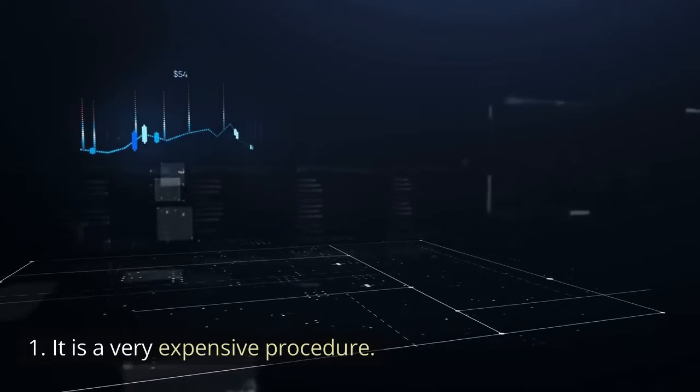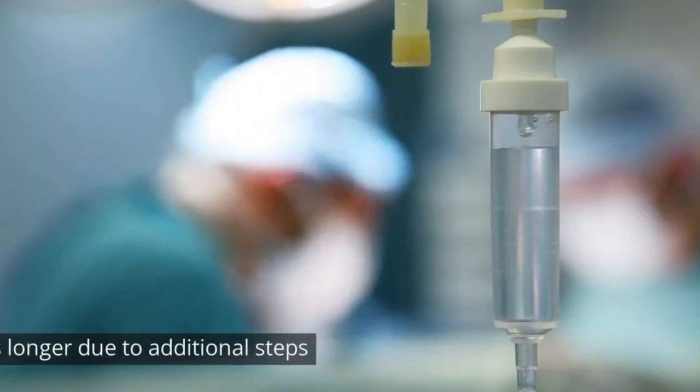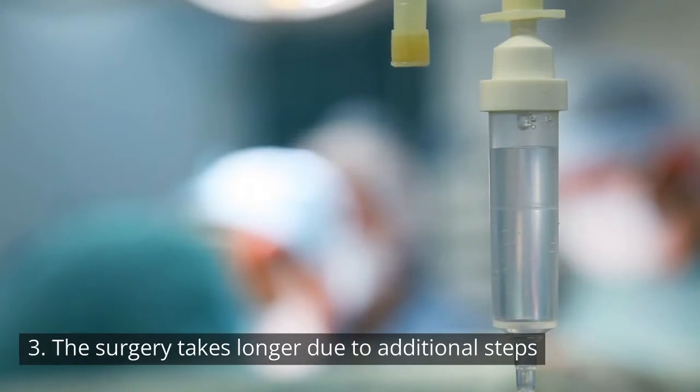Disadvantages: 1. It is a very expensive procedure. 2. Femtosecond laser is not available everywhere. 3. The surgery takes longer due to additional steps.